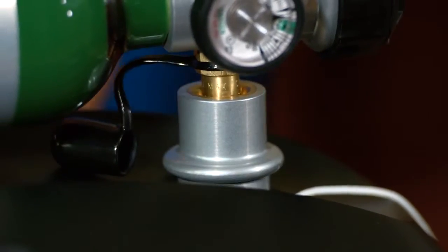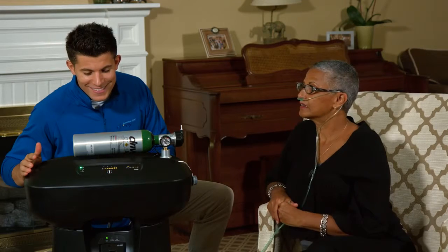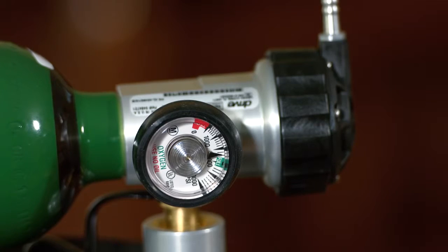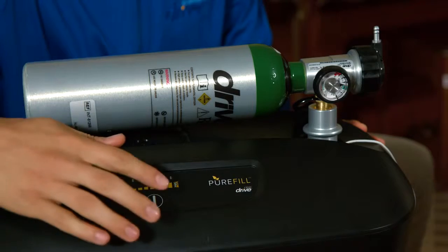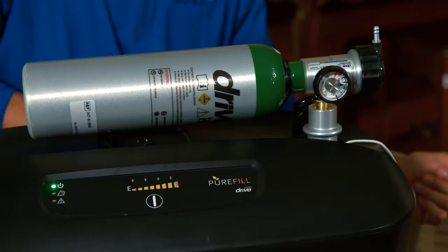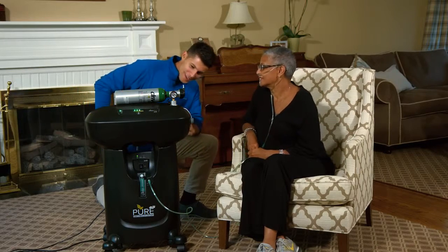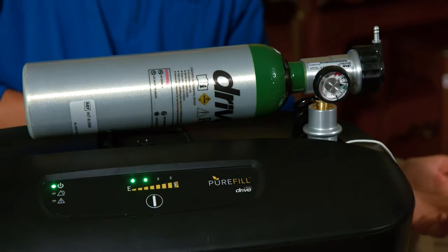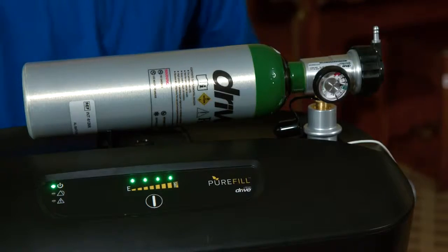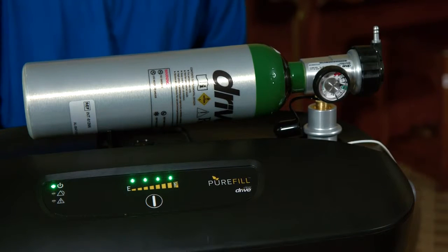At this point, the green dots will no longer be visible. Unlike other filling systems which require you to bleed oxygen from your cylinder before filling, the unique design of the PureFill permits cylinders to be topped off from any starting pressure. Press the fill button, and the first of the four fill LED lights will begin to blink. Each represents a quarter of the full capacity of your cylinder. So, for example, if two lights are solid and the third is blinking, your cylinder is between 50 and 75 percent full. Your fill time will vary, but expect about 80 to 90 minutes for an empty M6 cylinder to reach capacity.